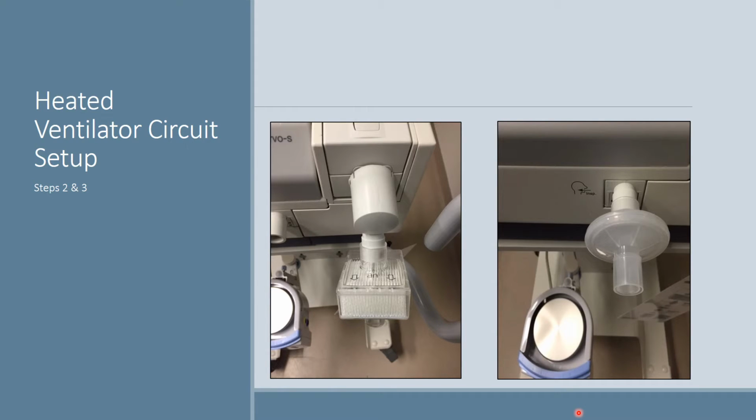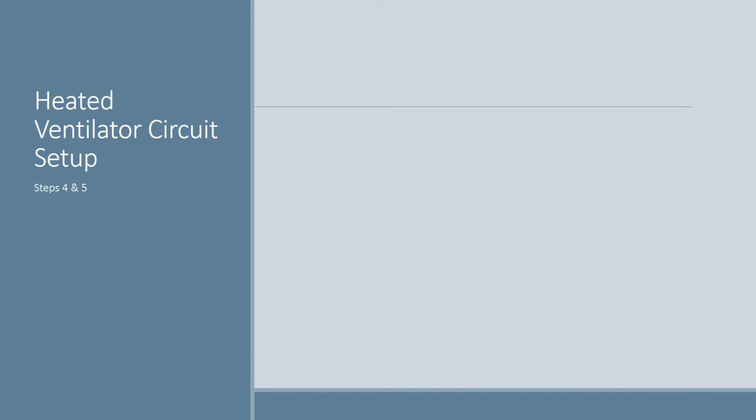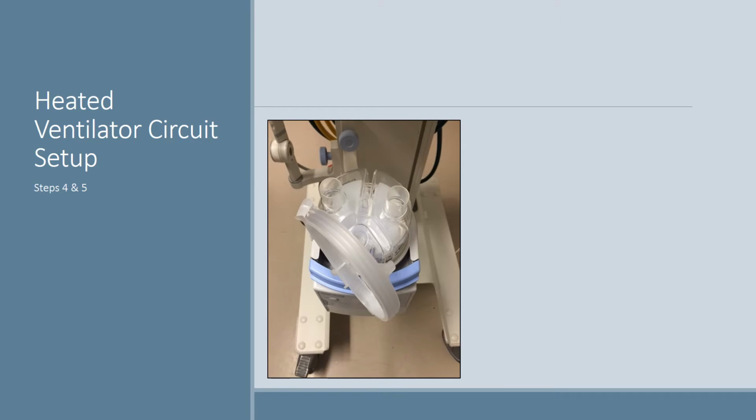Next, I'll connect my bacterial filter. This goes right on your inspiration. You can see here the inspiratory side is clearly stated so that you can differentiate which side these filters need to be placed. In step 4, I'll take that humidifier and place it onto this Fisher & Paykel heater. This actually slips right on. This blue piece will push down, the humidifier will slip into place, and these lips will catch it so that it's secured.